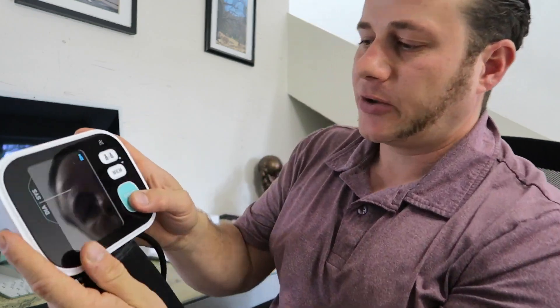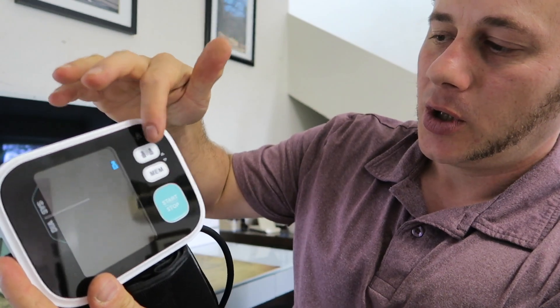It's also great that it stores memory inside the device and you can use A and B profiles, so me and my wife can both record our own settings separately.